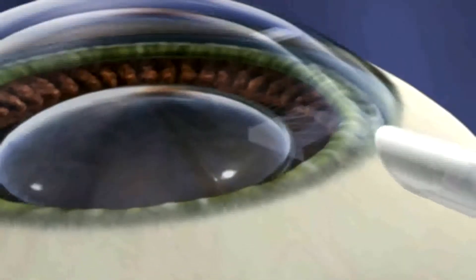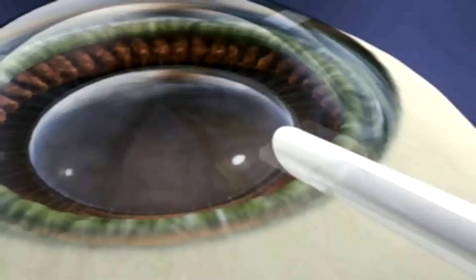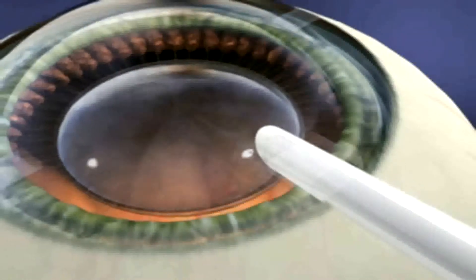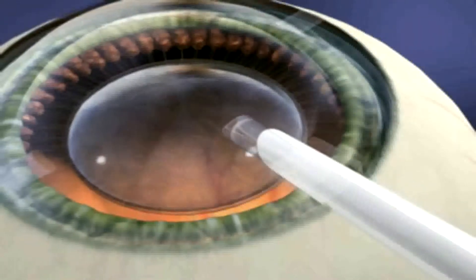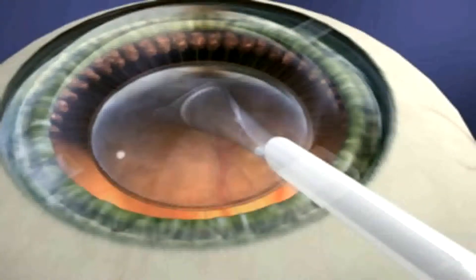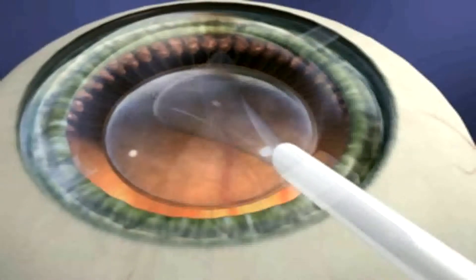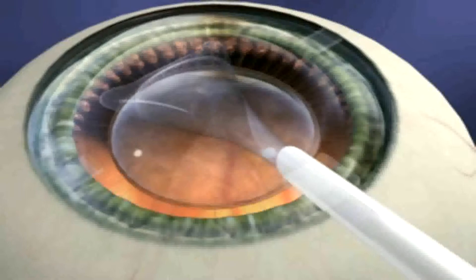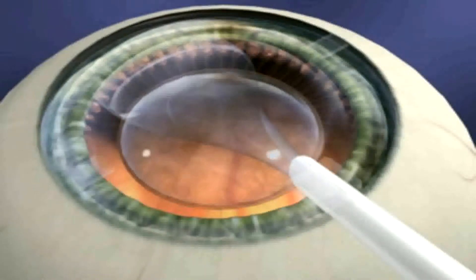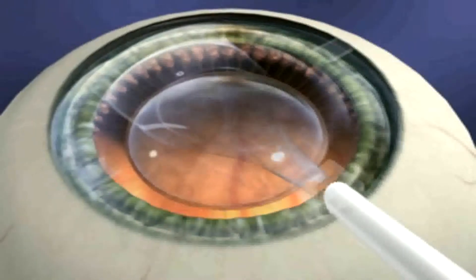You are now ready to inject the ICL. Place the tip of the cartridge with the bevel down just inside the incision. Slowly inject the ICL using a tapping motion until the leading right landmark is visible. The ICL will unfold in a slow and controlled manner. Do not fully inject the ICL until you see the landmarks. Remember, as long as the ICL remains within the cartridge, you still have control of the implantation process. Be patient.